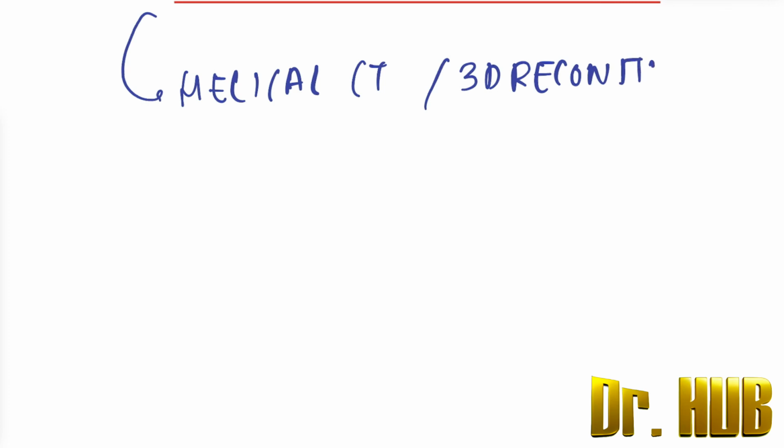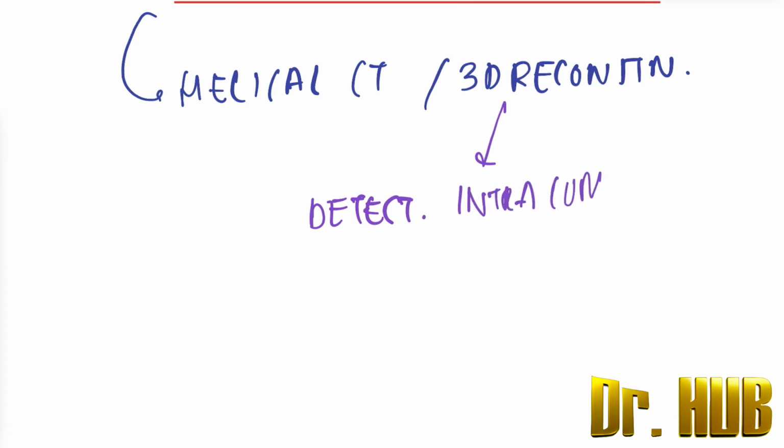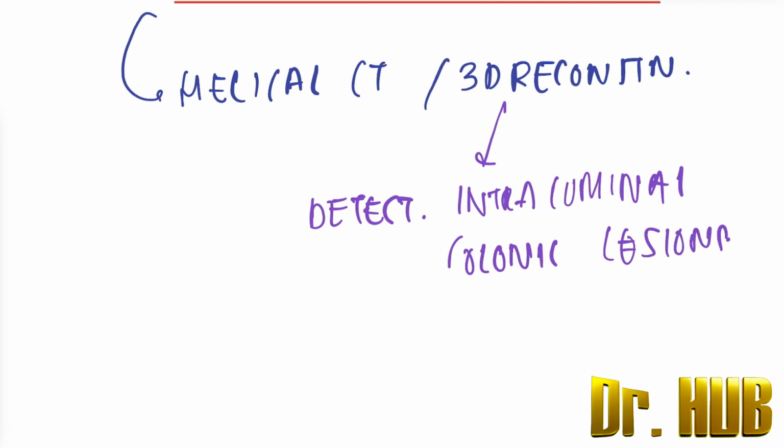It uses the helical CT as well as a three-dimensional reconstruction, and this is used to detect the intraluminal colonic lesions.